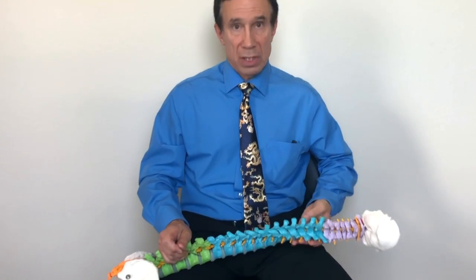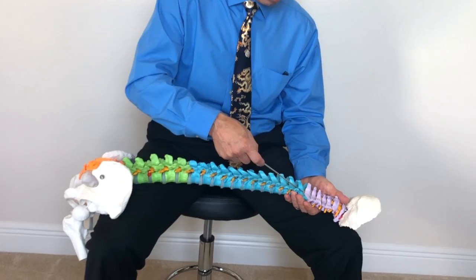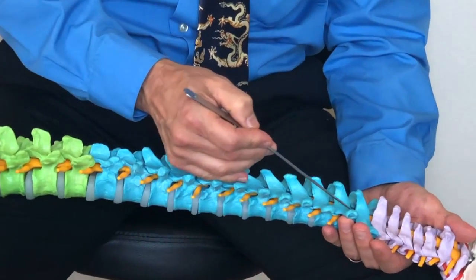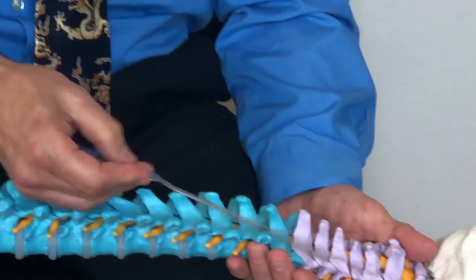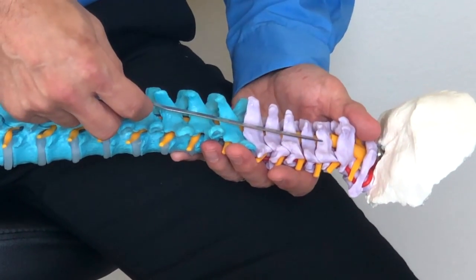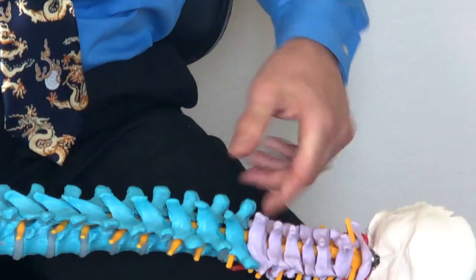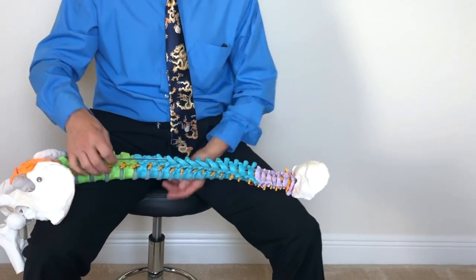If the problem was in the shoulder or arm, then we would be talking about placement of a needle up here at perhaps T1-2 or T2-3, and advancement of the electrodes up into the neck area, like this, except again inside the spinal canal. Otherwise, the technique of stimulation is identical.